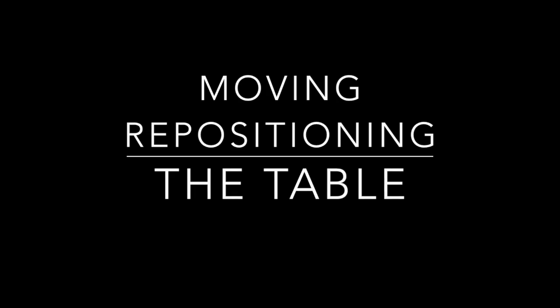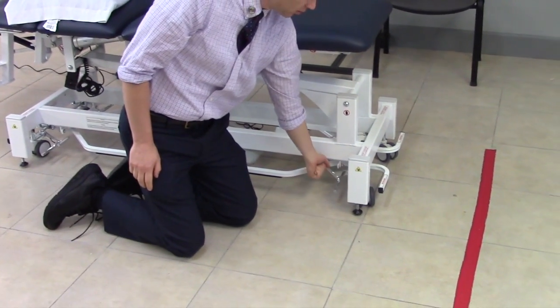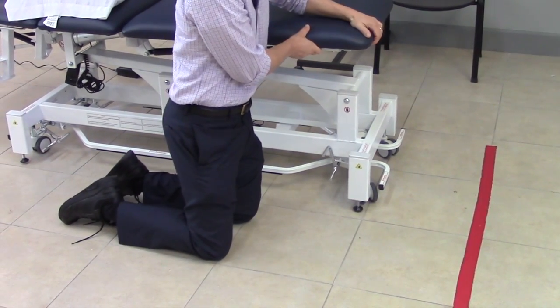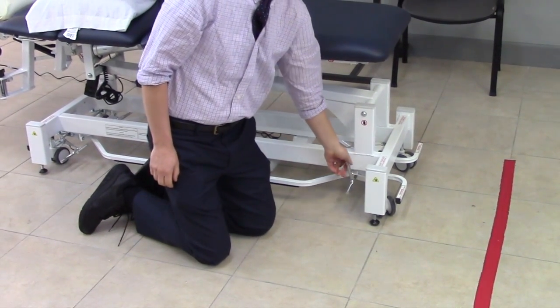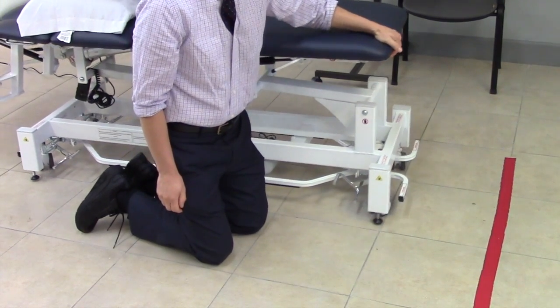Today we're going to show you the new Metron table and the different features that it has. To move the table, there's a little lever — one in the front and one in the back. When you pull it up, it locks the table in place. When you push it down, it lifts the table up, engaging the wheels and allowing for movement.